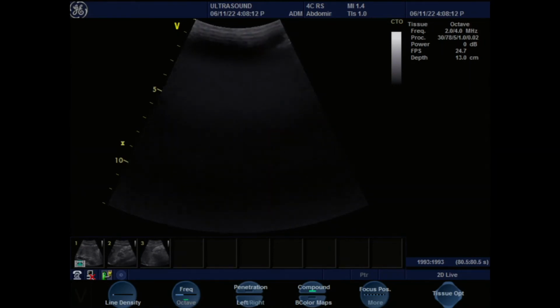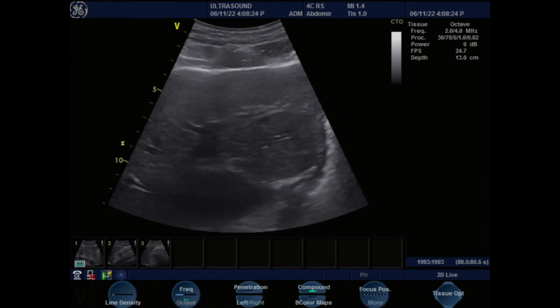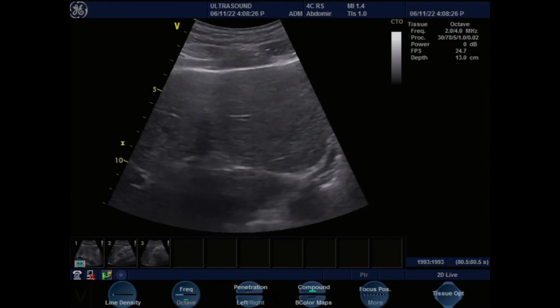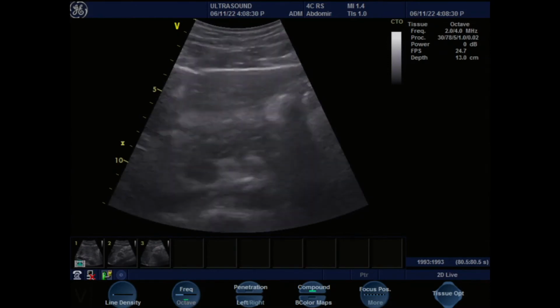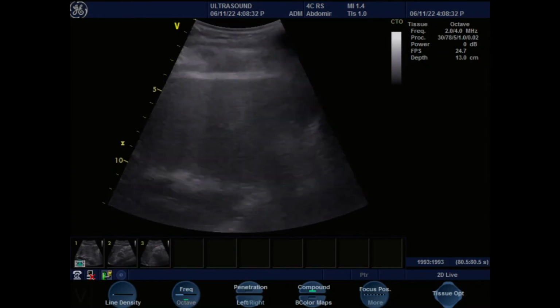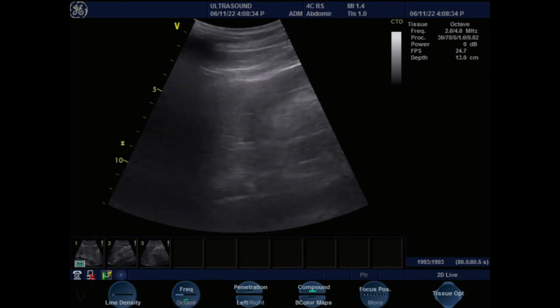So it's basically like a pencil in your hand, and you can swivel the probe around instead of moving your wrist and hurting your elbow and wrist. The lower you hold the probe, the more control you have over it, because with all the gel, everything is very slippery. You can rest your finger on the patient's belly, hold the probe, and then apply appropriate pressure. So the lower you hold the probe, the better.